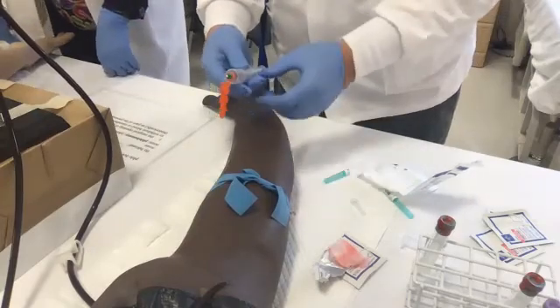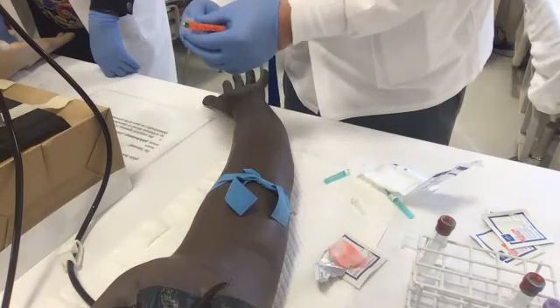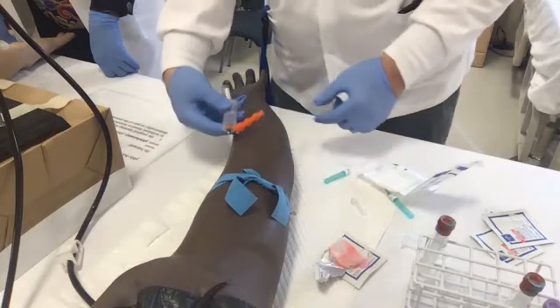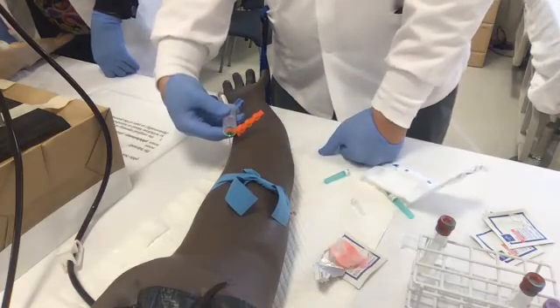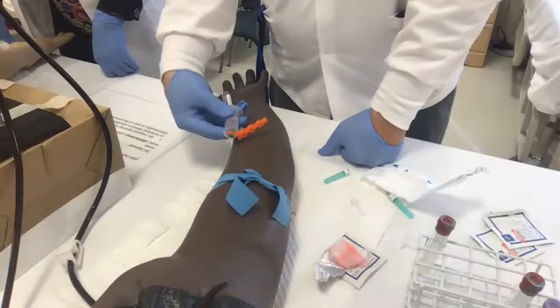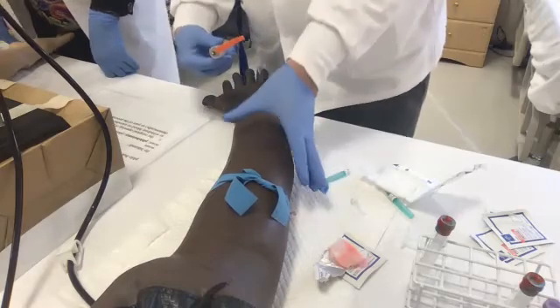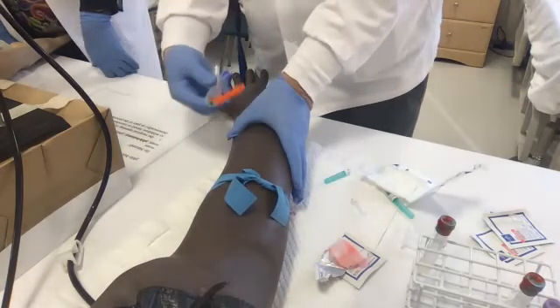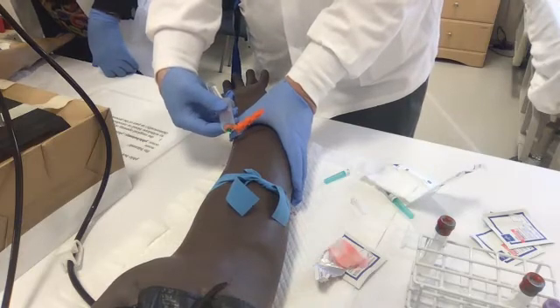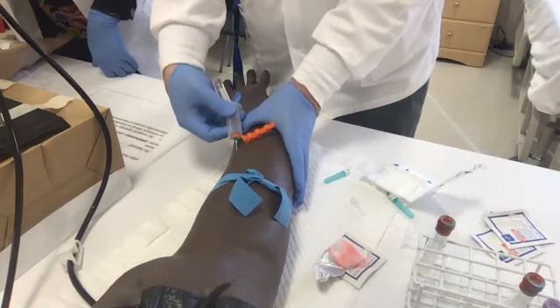Now I remove the cover. I can move this thing around because, do you see how the hole is up? That's your bevel. And you should hit bevel up at a 15-degree down angle. So it's not matching the level of the skin, but it's coming close. I anchor with my non-dominant hand 2 to 3 centimeters underneath where my puncture is going to be. So bevel up, I go in and I go in, whoop, just like that.